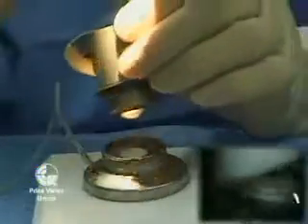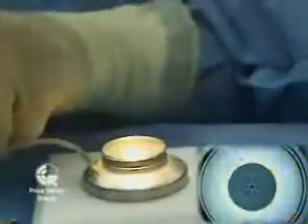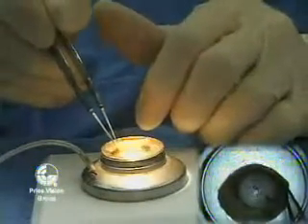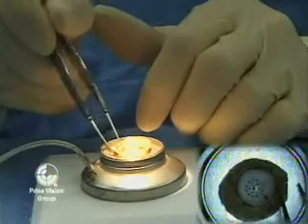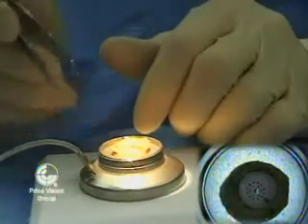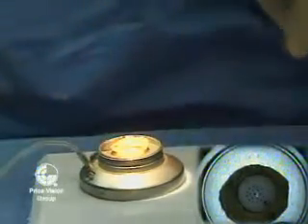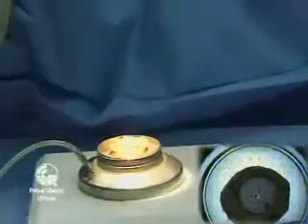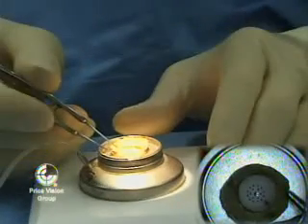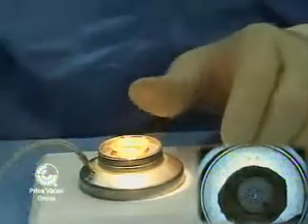We're now going to remove the donor cornea with the cap on the surface and line it up with the center of the cutting block. Now once it's lined up and in position, we'll put some more tissue storage solution on top of the endothelium to help protect it. And we'll also hook up the wall suction to the block to help fixate the donor cornea in place. But we don't hook up the wall suction until we're sure that the donor cornea is in the proper position.